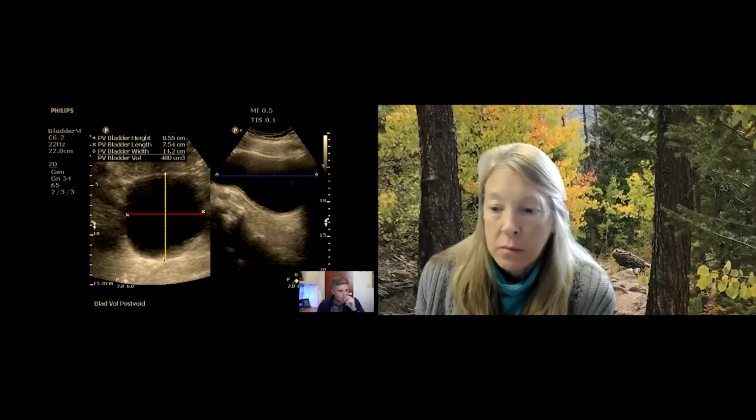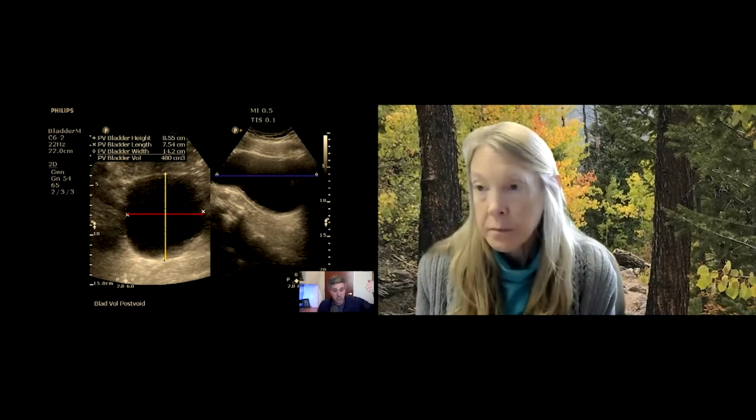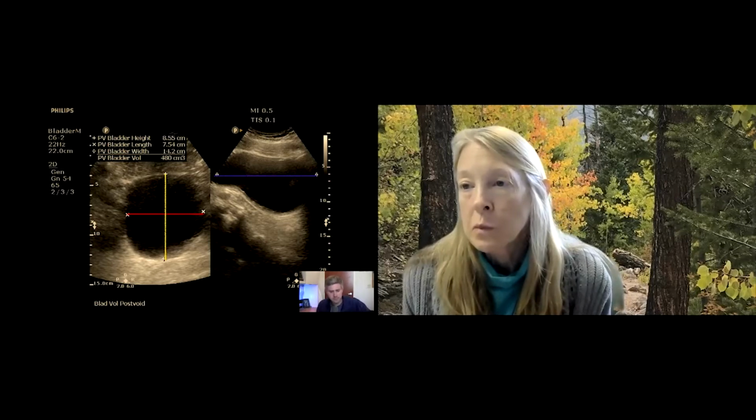One important thing though, when you make the measurement, is you actually have to measure the three different dimensions, right? The length, the height, and the width. So in this image here, we're showing that on the left you have your transverse oriented bladder, right? As we're looking at this patient, anterior is going to be in the near field, posterior is going to be in the far field, and left and right on the images are actually going to be inverted because of the way radiology images are read.